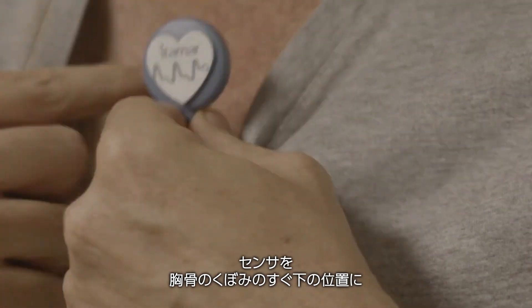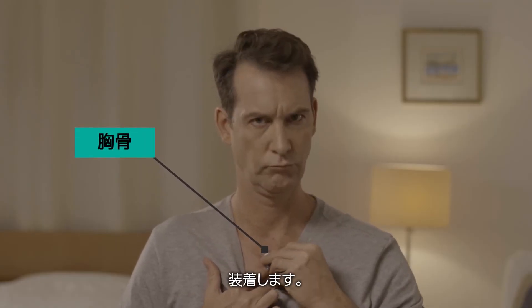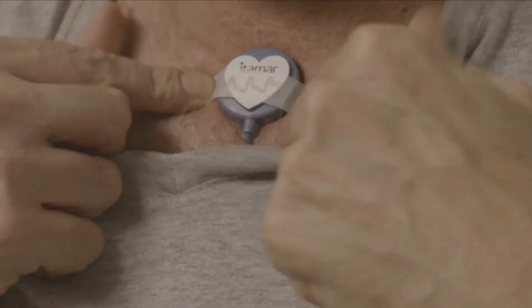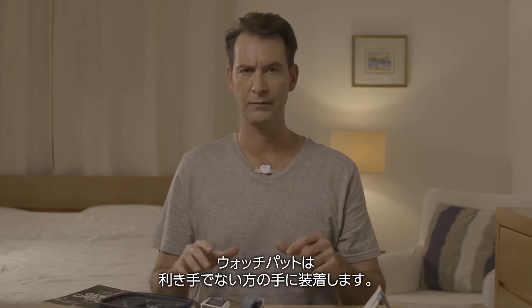Attach the sensor to the sternum, a bit lower — just below the sternum notch. If medical tape is provided, please use it to secure the sensor in place. You'll be putting the WatchPAD on your non-dominant hand.